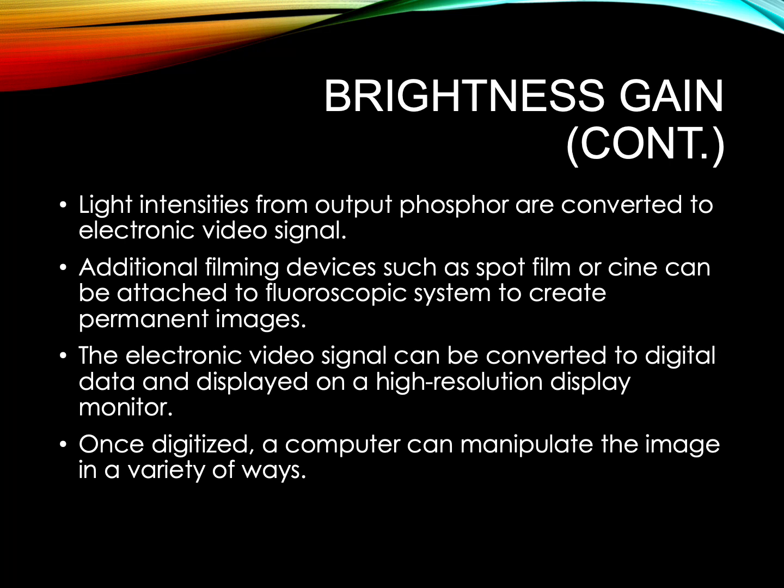But whether the radiographic image is displayed on a computer monitor or on film, the process of differential absorption for image formation remains the same. The varying X-ray intensities exiting the anatomic area of interest form the image. And then in chapter 14, there will be further discussion of radiographic image characteristics, exposure technique selection, image receptors, the control of scatter radiation, and then problem solving, all in chapter 14. So we'll talk about this a little bit more later, but that is the end of this chapter.